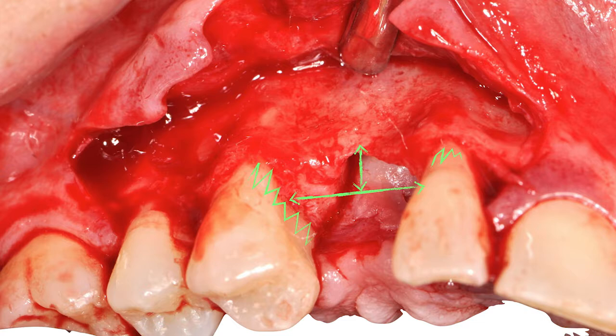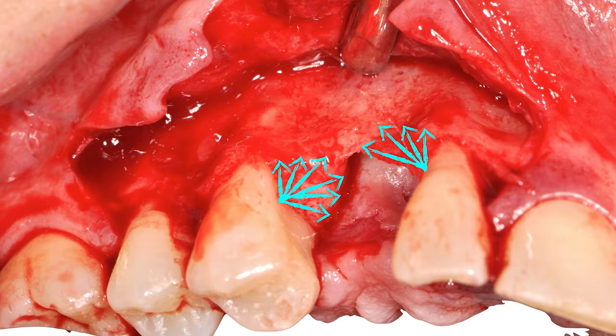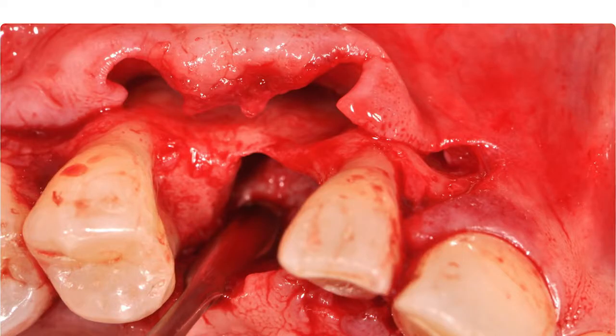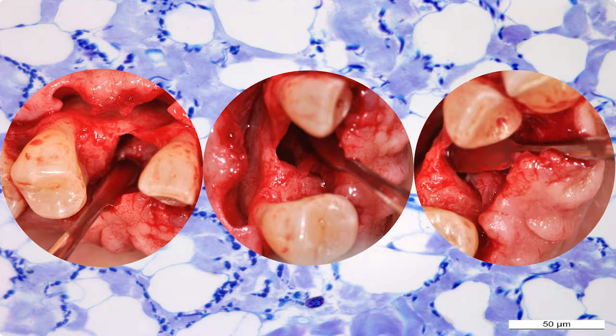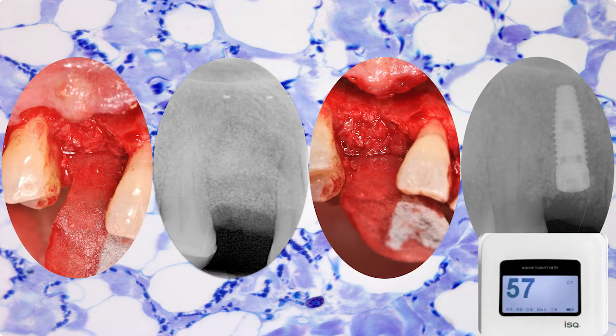This case is also unique because generally we have a buccolingual collapse of the ridge after extractions. Here there is a residual bony defect towards the palatal side. I have limitations due to the reduced periodontium, so I cannot go beyond the bone housing if I want to keep it safe and long-lasting, which is very important. How do we stabilize titanium mesh or titanium-reinforced membrane here on the palatal side? That's another case where I use resorbable collagen membrane and a mixture of autologous bone and biomaterials.